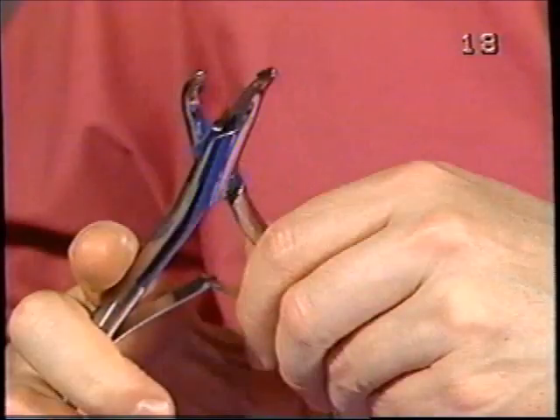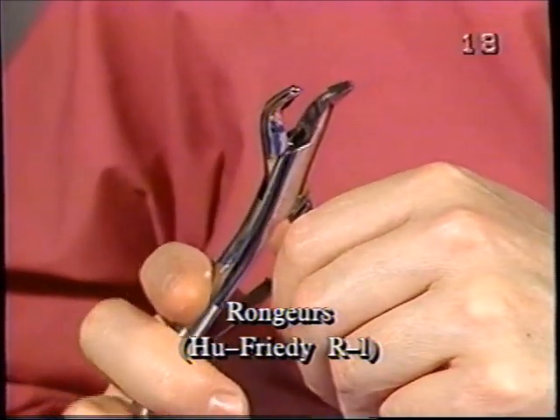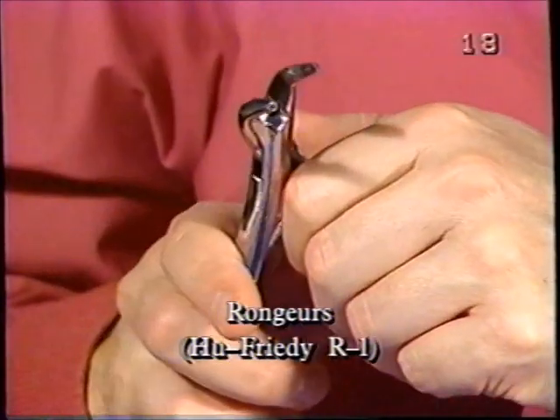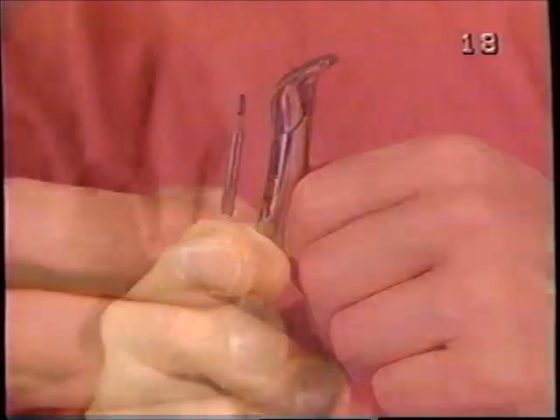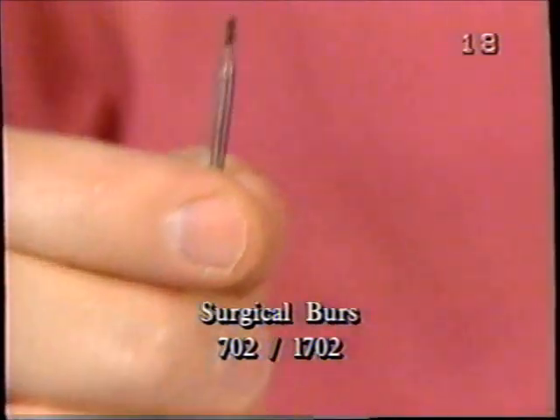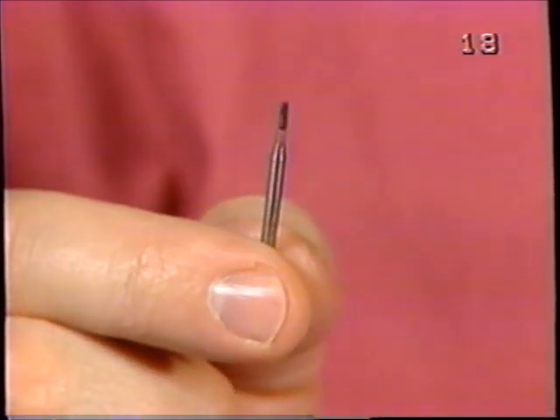And we must mention rongeurs. It's just which one do you want to talk about? Well, this one happens to be the R1 Hugh Freedy, both end cutting and side cutting, a feature you definitely want. And then the fourth method of smoothing bone would be to use either your high speed or your straight handpiece and a small burr like this, which is the 702 or 1702.